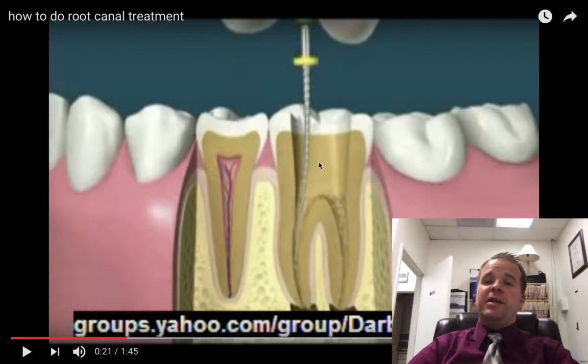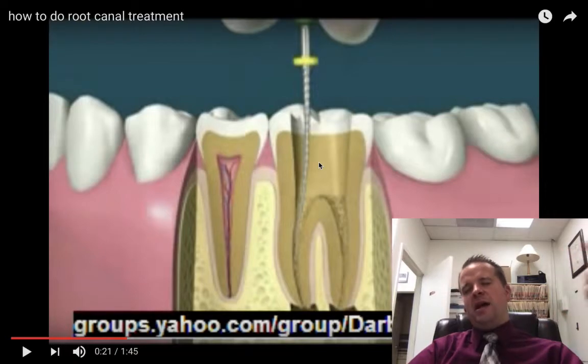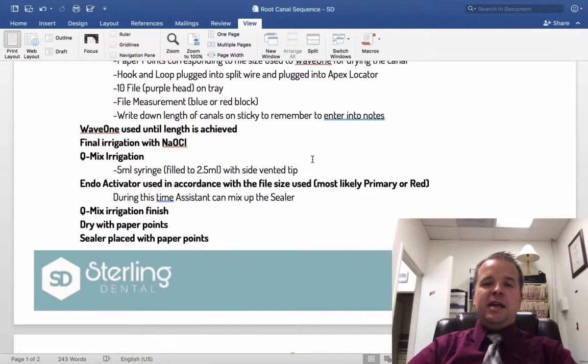And usually the dentist will say, all right, I've gotten to the end of the mesial buccal, I've gotten to the end of the distal buccal, et cetera, et cetera. And I think we're getting close, and he'll kind of keep you updated on how much is cleaned out, because you can't really see down in there. Once he kind of gives you that indicator, once everything is cleaned out, you'll do a final rinse of bleach. Make sure that everything's cleaned out.